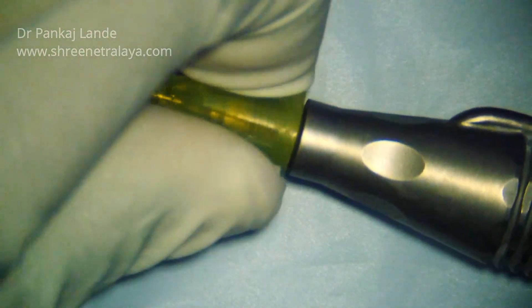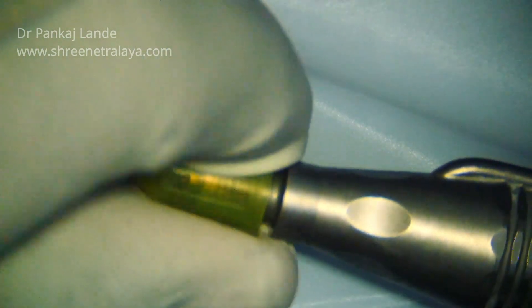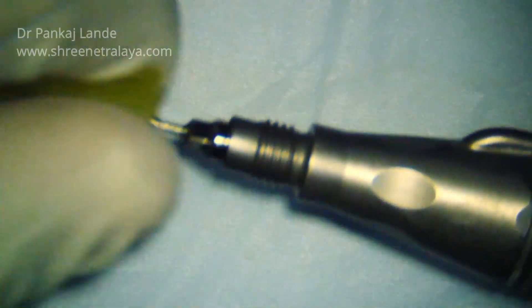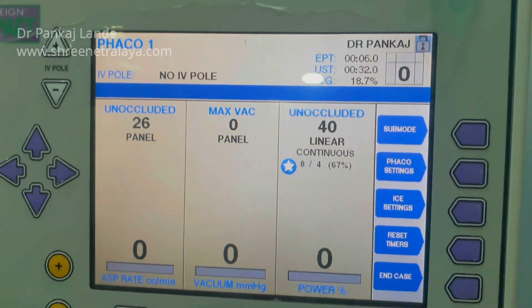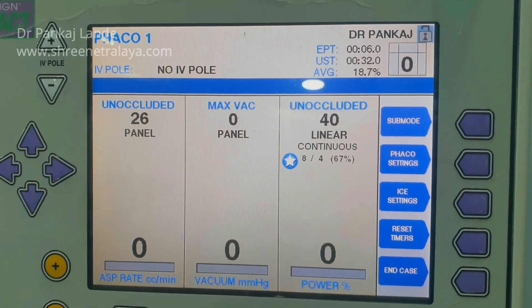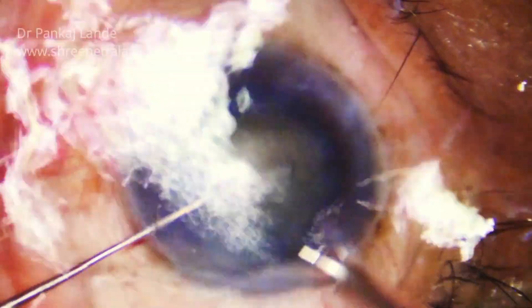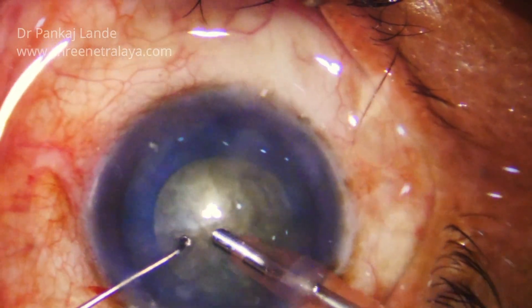Over the tip you can use your sleeve as per your incision size. I usually use a 2.6 mm incision size and have the sleeve for the same. You have to be careful while fixing it. These are the machine settings with aspiration rate of 26, vacuum 0, and a continuous power of 40.